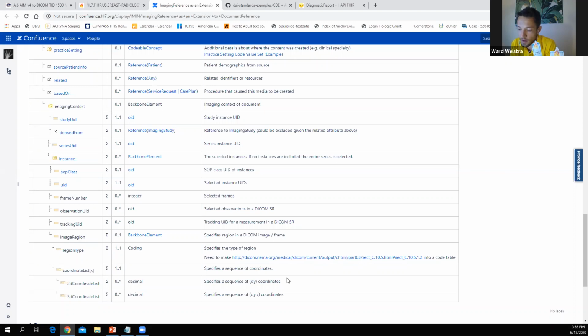And then there's another from Rajiv Pillai. Does it capture image annotations references to timeline or similar studies on the same patient? So yes, a couple of things. Because I'm looking at a particular study instance UID, I can then line that up with the patient record.